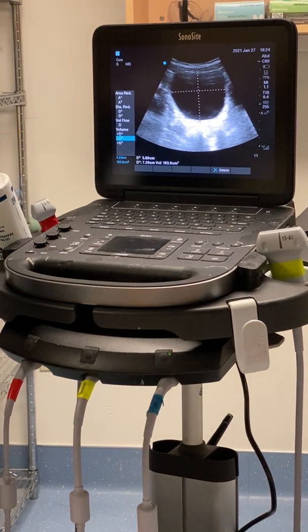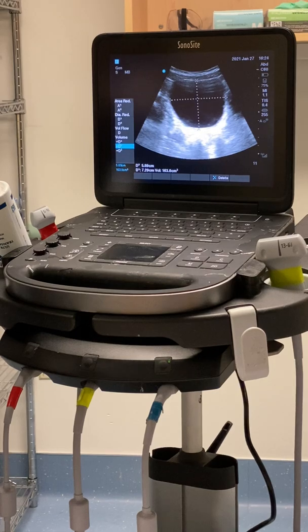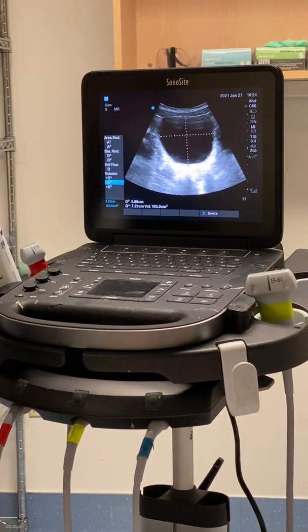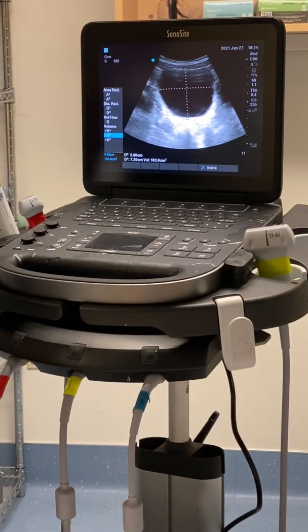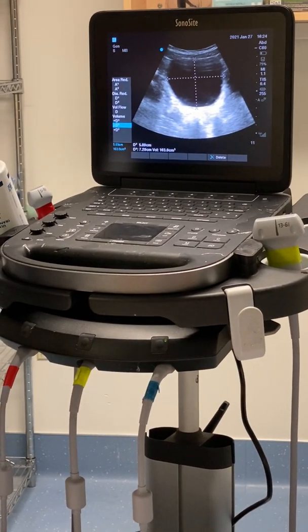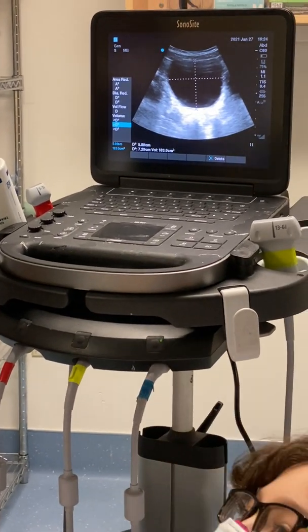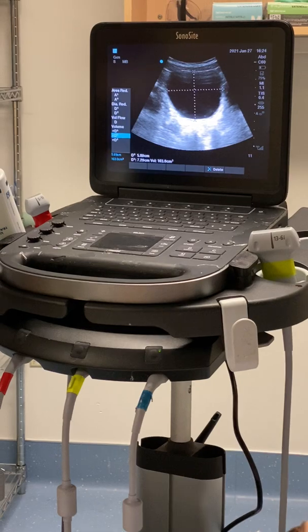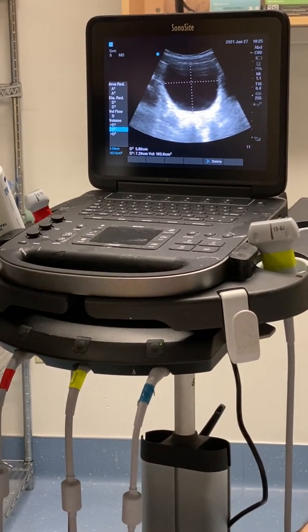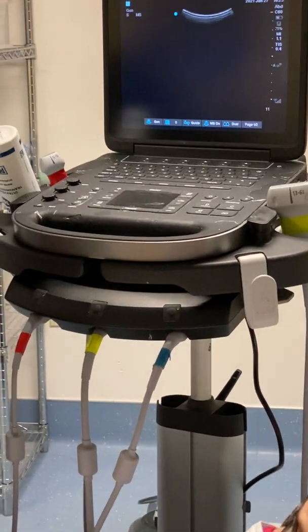Now we need to get the height of the bladder. The way you measure bladder volume is height times width times depth. Because it's a weird-shaped bladder, they estimate using a coefficient — this machine probably uses a coefficient of 0.7. That gets you your measurement. You don't have to think about it because the machine does the calculation for you.